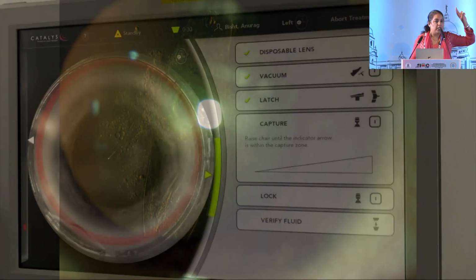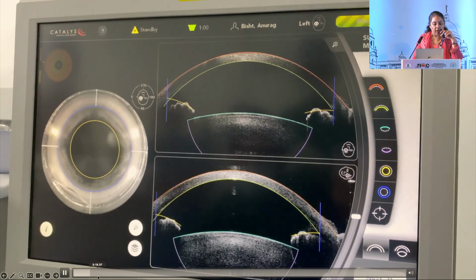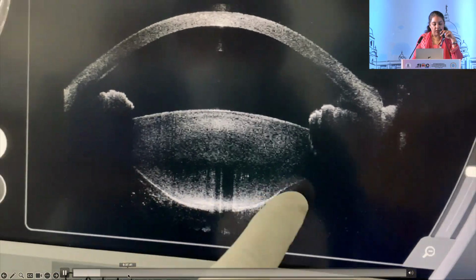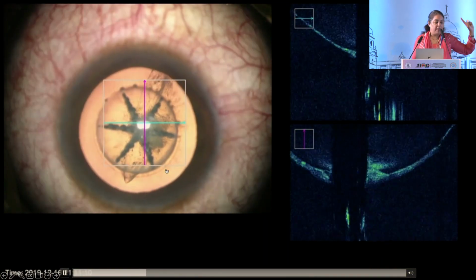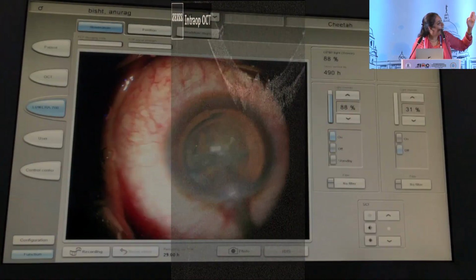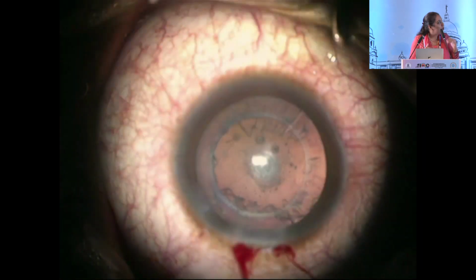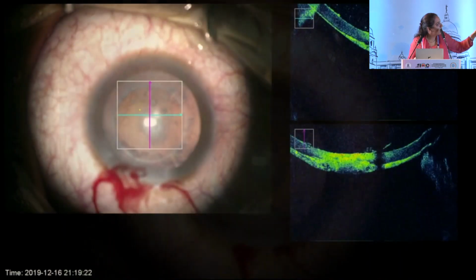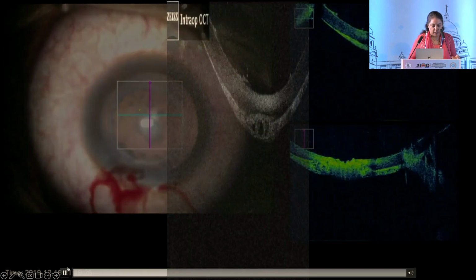This is a patient with a pre-existing large PC rip. This is a posterior polar cataract. I'm using a femto platform here. You see here, I am showing you the integrated OCT just to make you understand that the epinucleus cushion is a great buttress to prevent nucleus dropping. So this is the end of the case, but I'll just try to see if I can pause.